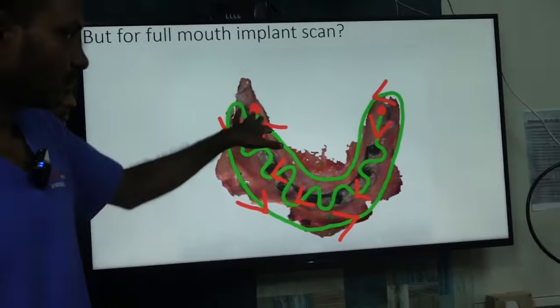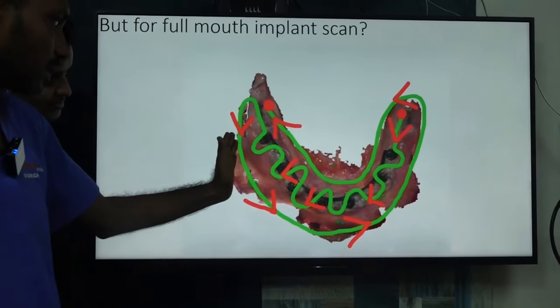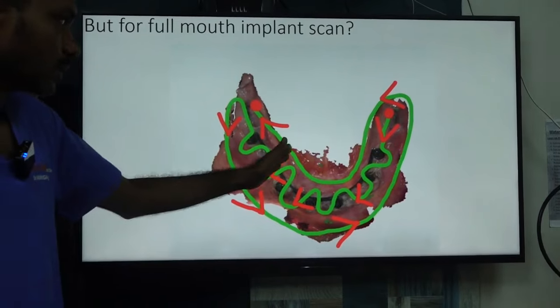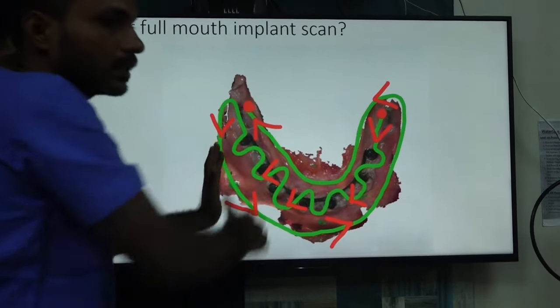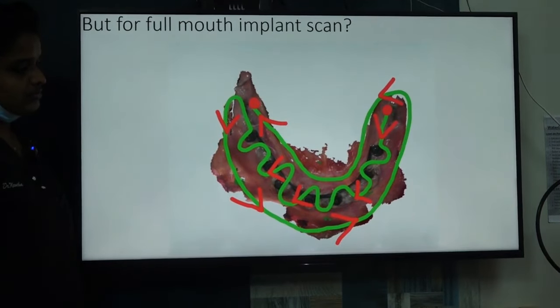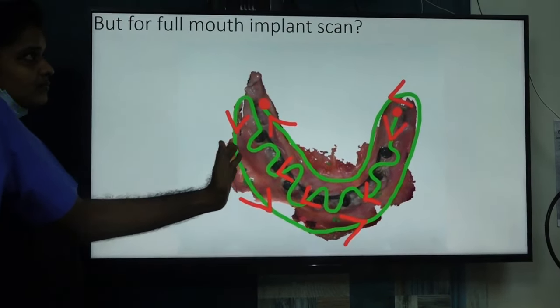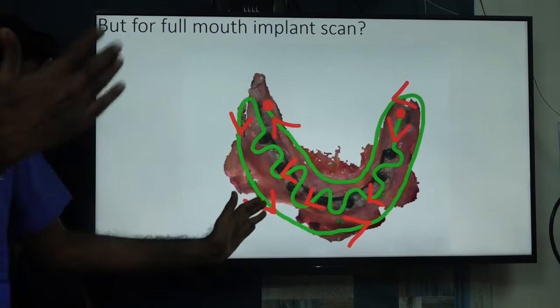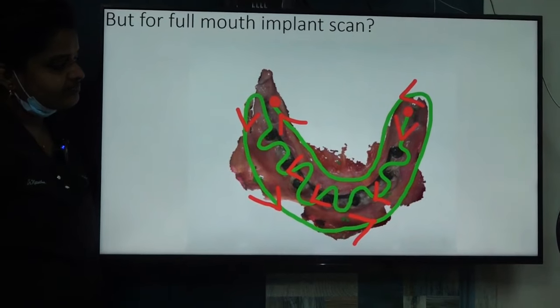But whatever it is, when you go lingual, what is the retraction technique you have to follow, right? You have to retract here when you go lingually. When you scan buccally, you have to retract the tongue. Wherever you are keeping the scanner itself retracts. There is no need to retract on that side, opposite side only, otherwise double scanning will happen. So you have to do the retraction.